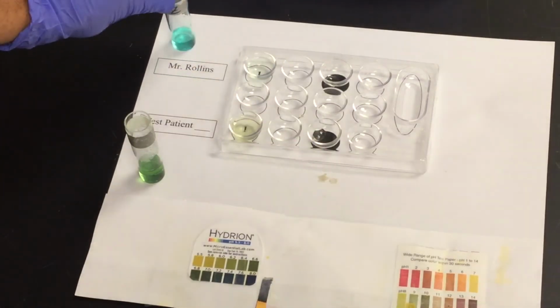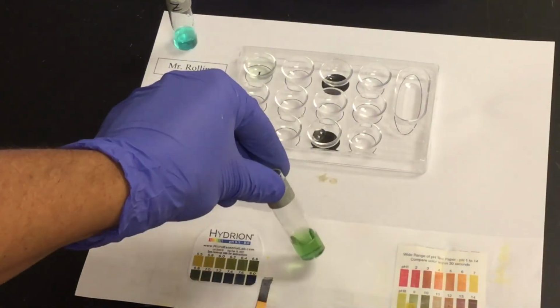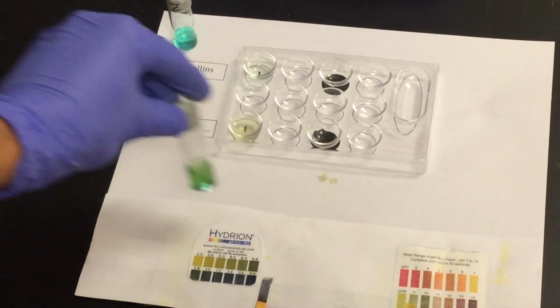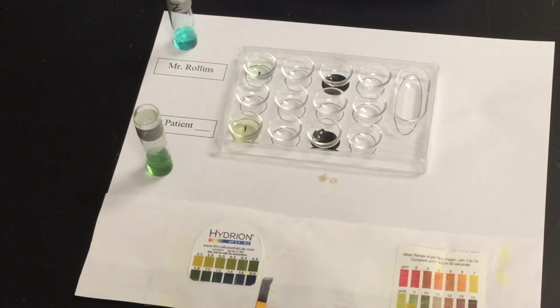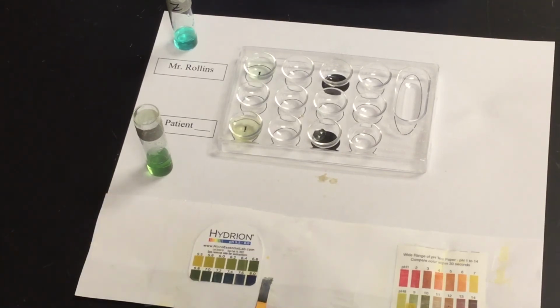Within your lab, you have a little data chart. It says anything that turns green, which is what we have there, might be a 1+. A darker green orangey color would be 2+. If it is bright red, well then it would be 3+. So tons and tons of sugar. Here we've got a little bit of sugar. So we've got a high pH and a clear solution. It is clear, but we also just have a tinge of sugar in it.